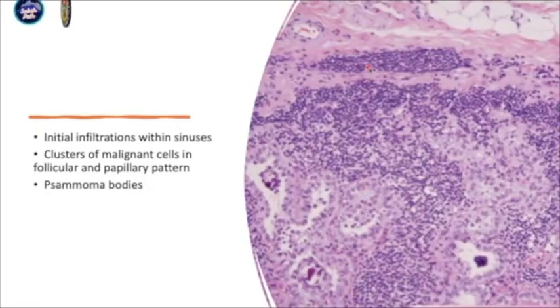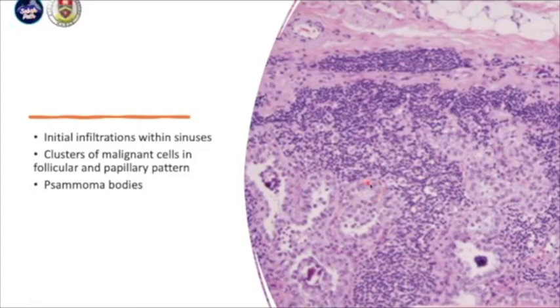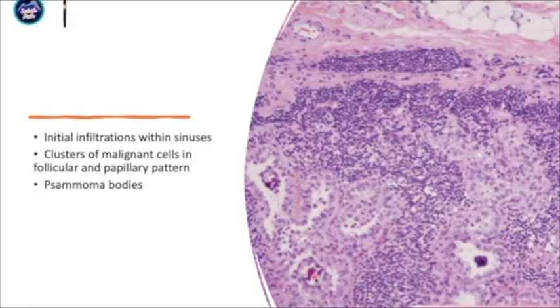What do I mean by papillary pattern? It's like a finger-like projection, and in the center you have this blood vessel. So this is the malignant cell arranged in papillary pattern. In the initial phase, usually it's infiltration within the sinus or subcapsular region. And you can see the clusters of malignant cells — here in the follicular pattern, and here you can see the papillary pattern with finger-like projections and blood vessels in the center.